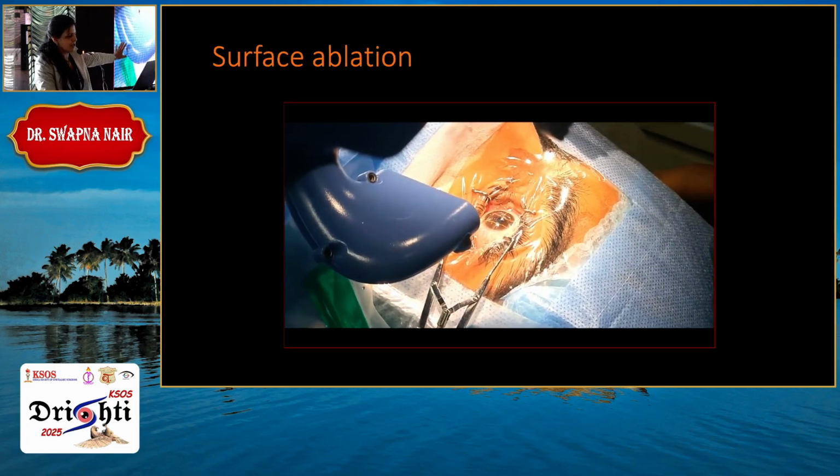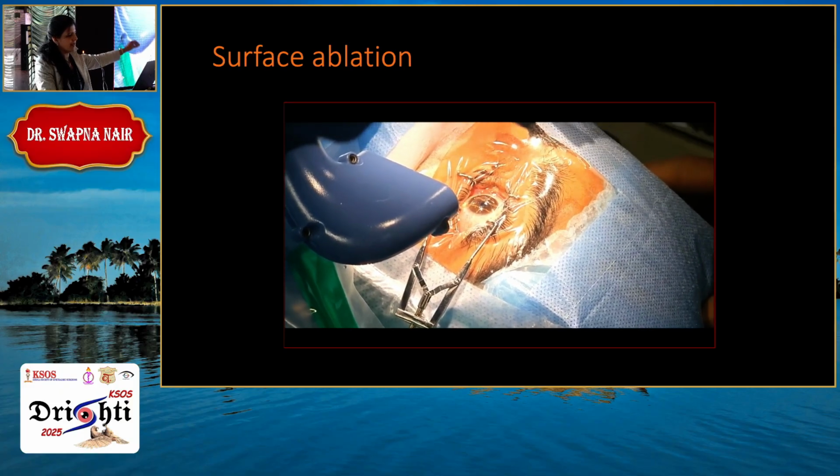So this is how surface ablation works. So this is the patient lying down after draping and the laser keeps on firing.